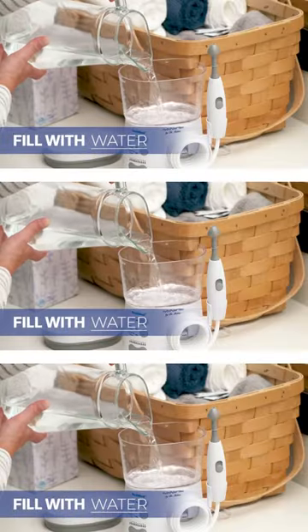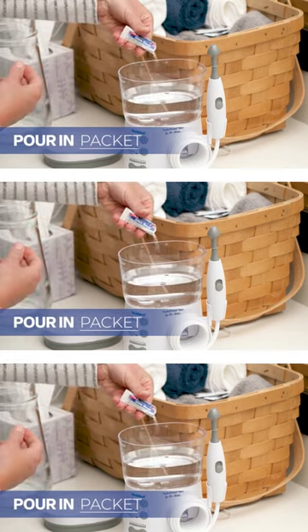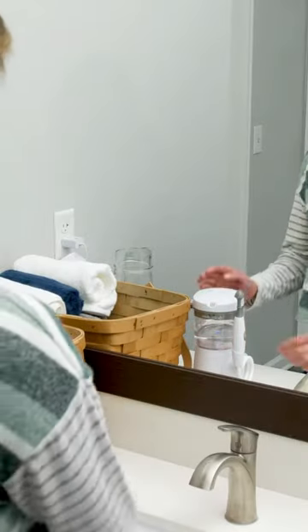To use the NealMed HydroPulse Neo, fill the water container with previously boiled, filtered, or bottled water. Stir one packet of NealMed sinus rinse into the water — it will dissolve immediately. Stand over the sink and select your desired flow speed.